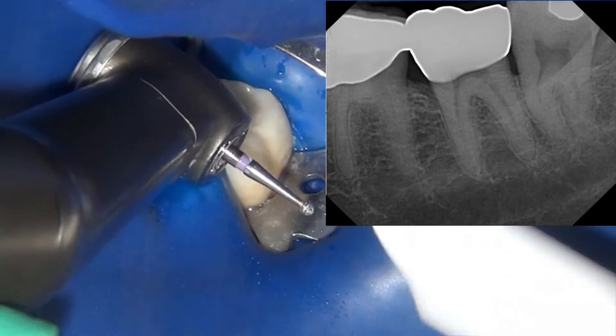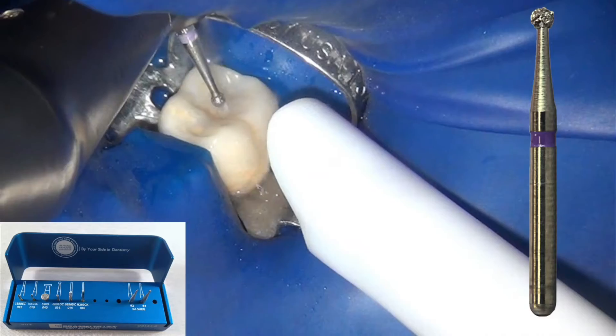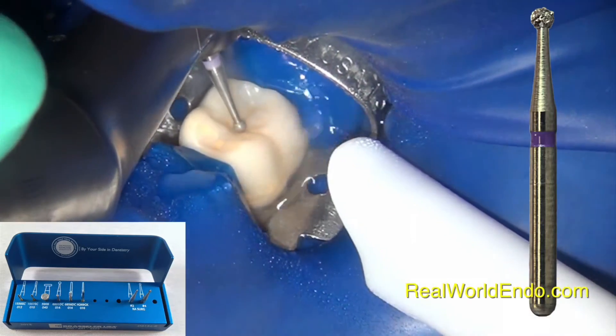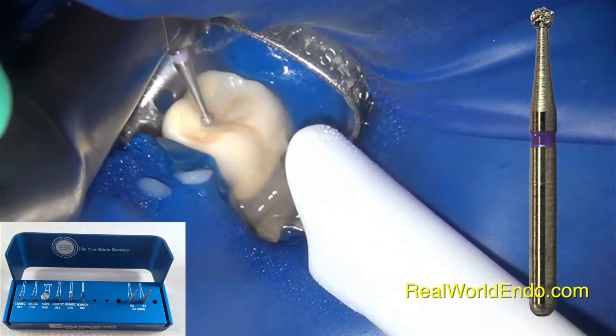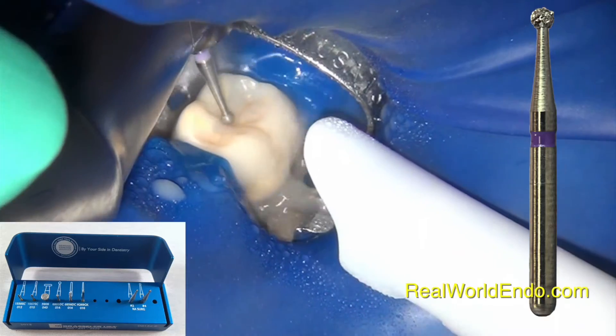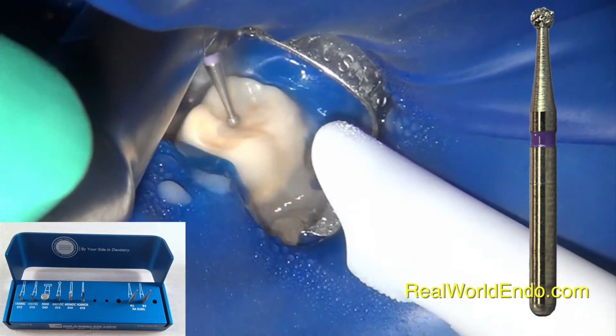As anyone who has cut through a zirconia crown understands, it is a very difficult and unforgiving material. It is very hard, and at the same time it is prone to cracks and fractures if the material heats up.